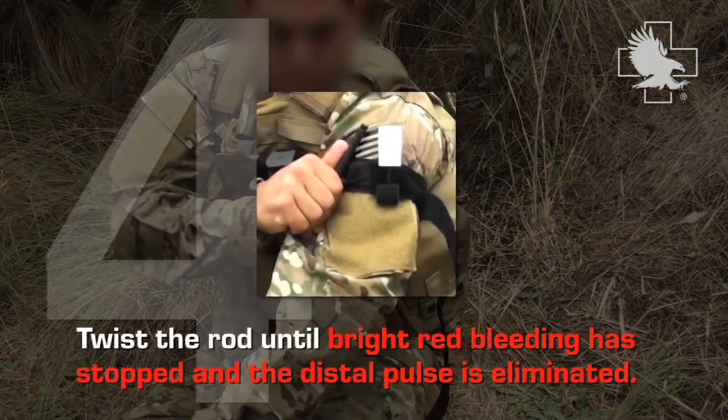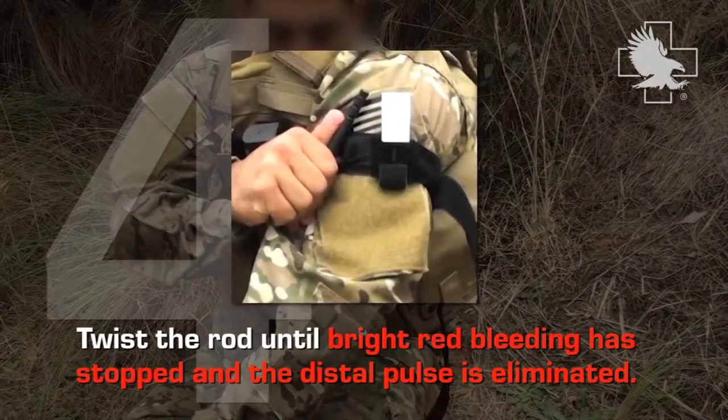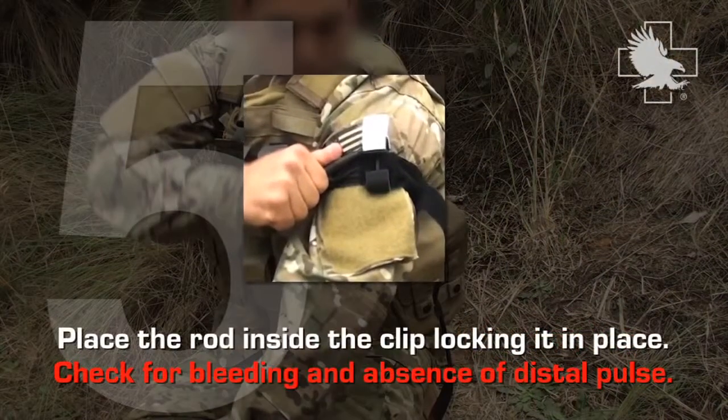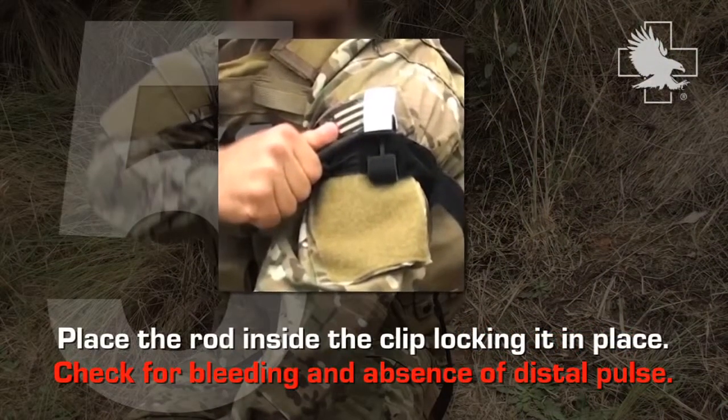Twist the rod until bright red bleeding has stopped and the distal pulse is eliminated. Place the rod inside the clip, locking it in place. Check for bleeding and absence of distal pulse.